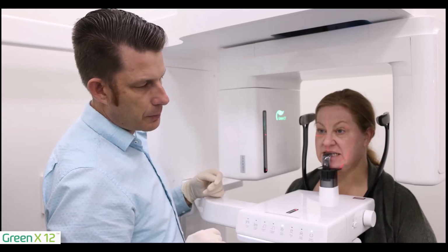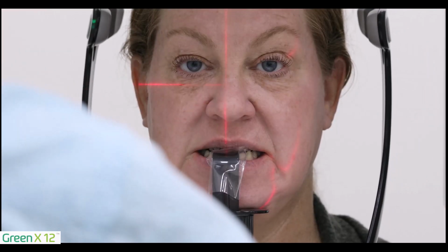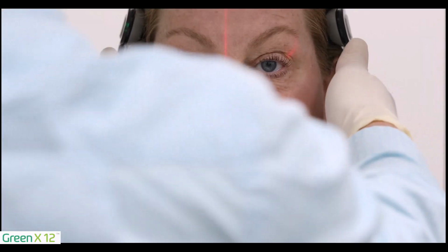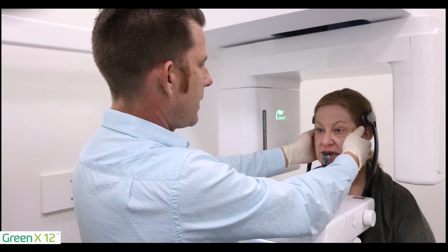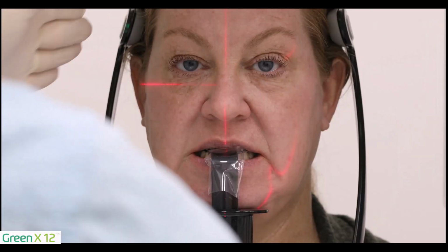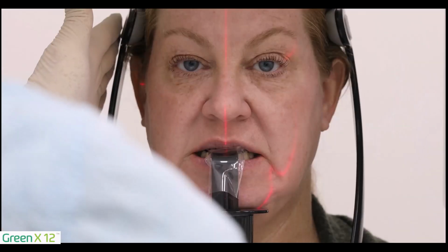Next, I'm going to go ahead and close my temple supports, and on the green platform, I can just use the wheel on the side of the column here and tighten the patient down. And I want to ensure the patient's lined up. I'm going to go ahead and twist here so you can see that the patient is back lined up center. On this wheel, right now, the temple supports are just touching the head. I want to actually crank that down so you can see, make sure that that's very firm.